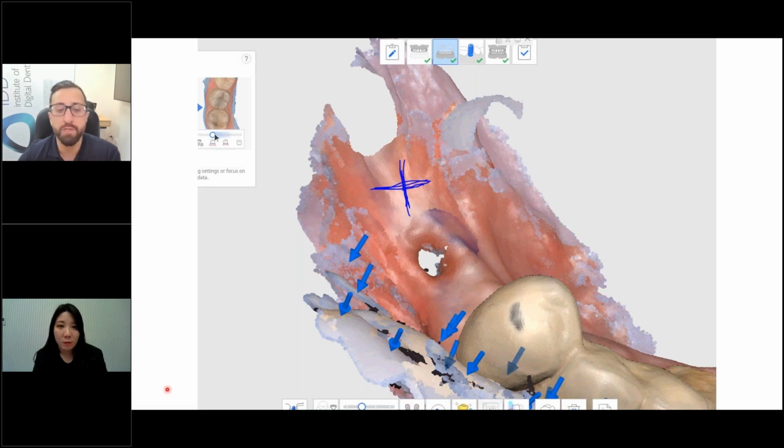If you are having an issue, I need to check your software, because sometimes your associates play with the scanner and you don't have the right scan depth setting, or you don't have the right AI setting. I see maybe this is a screenshot and the user looks like they may be in the right AI setting. But these are all factors I would check.